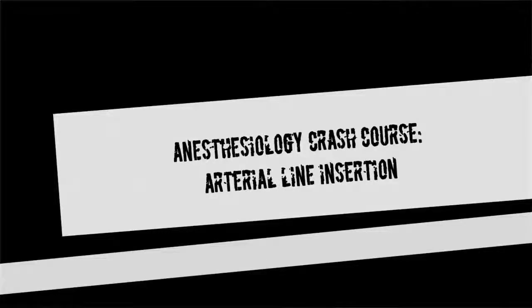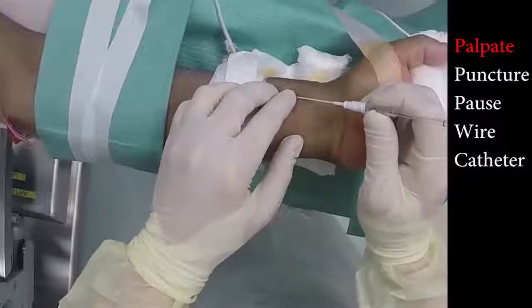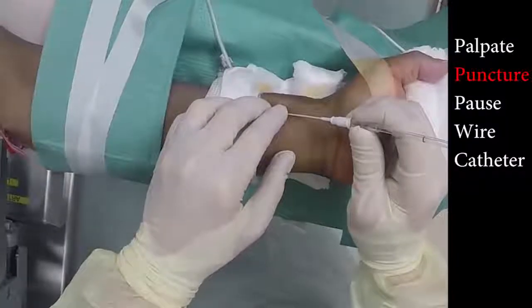This is an introduction to arterial line placement. This is an easy procedure to perform. Let's watch the ease and quickness this can be accomplished.